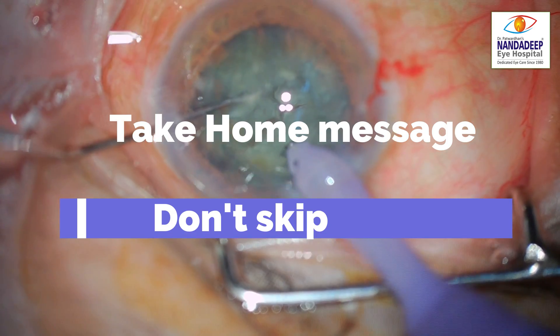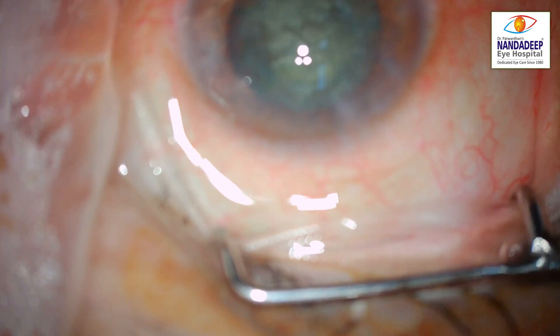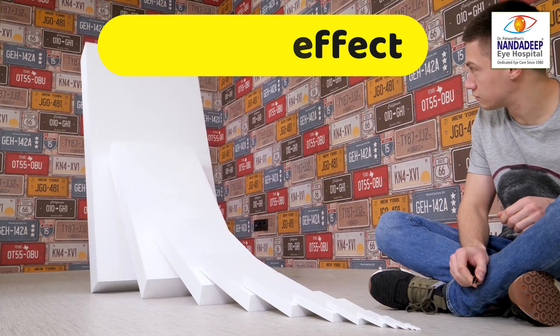Incomplete steps in phaco — if you skip steps it is similar to having a domino effect. A small step can lead to catastrophic complications. Thank you.